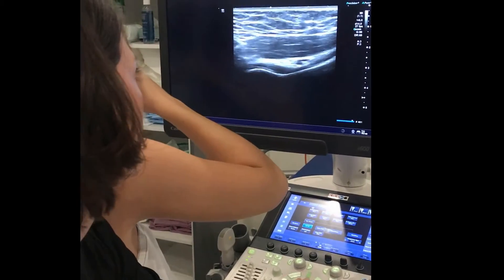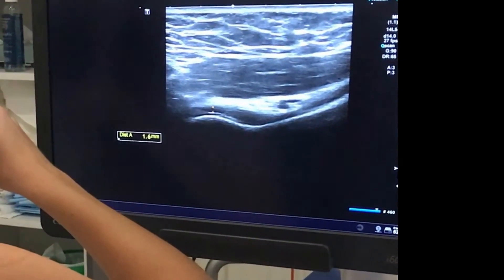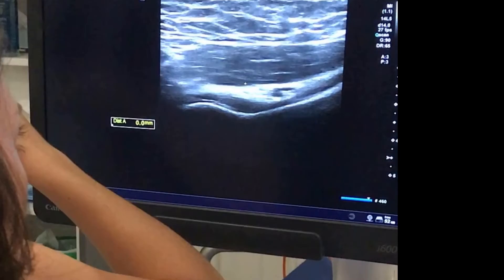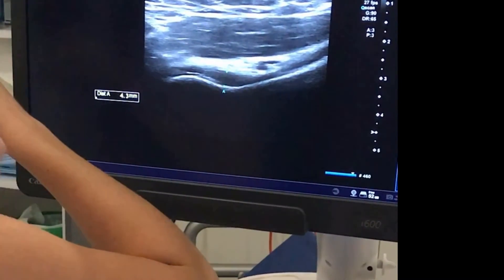Over the humeral head, the cutoff is 2mm — don't include the cartilage; measure from here to here. If measuring at the neck, include from the bone up to the top of the capsule, which has a different cutoff.